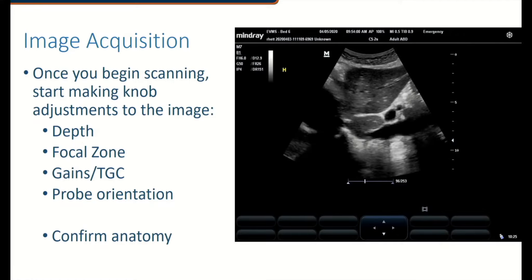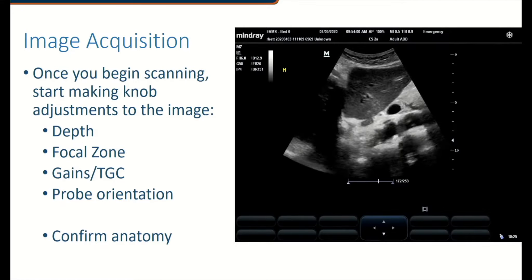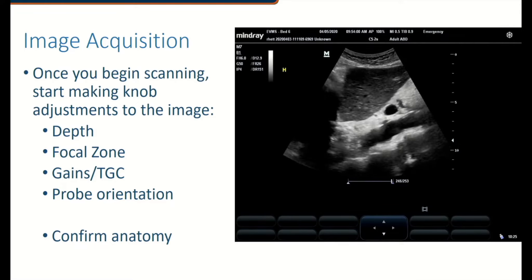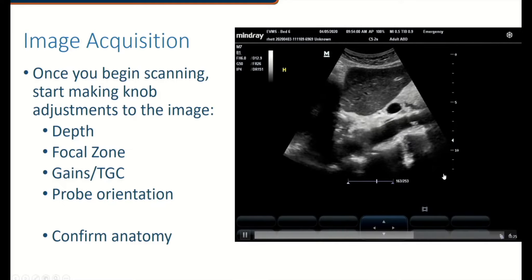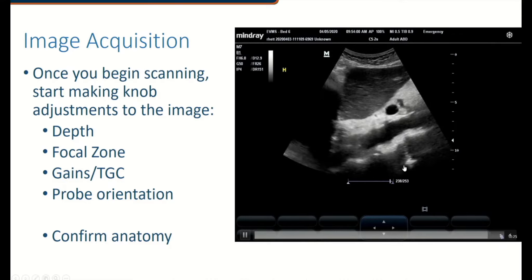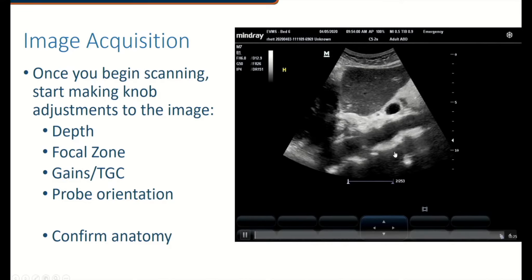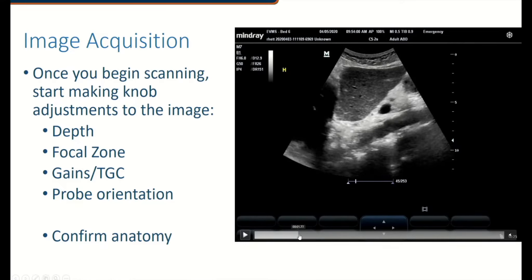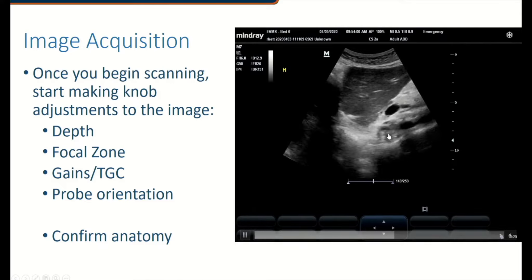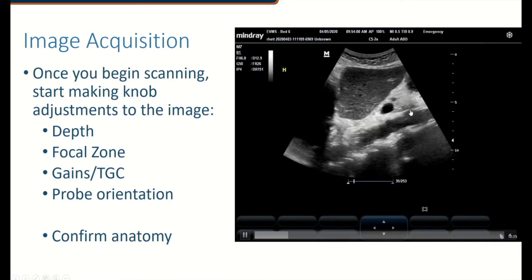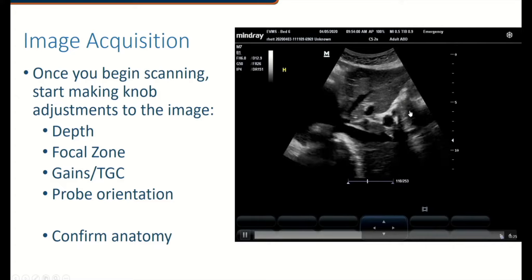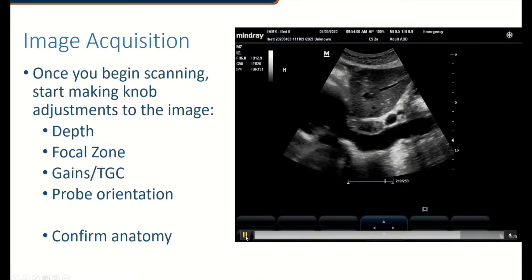As we measure and evaluate the aorta, I want to make sure that you confirm your anatomy. On this video, notice that I'm sliding between the right-sided IVC and the left-sided aorta — here is aorta, and here is IVC. You're going to see that they look quite different in a normal patient, though that distinction might be more difficult to identify if there is some pathology.